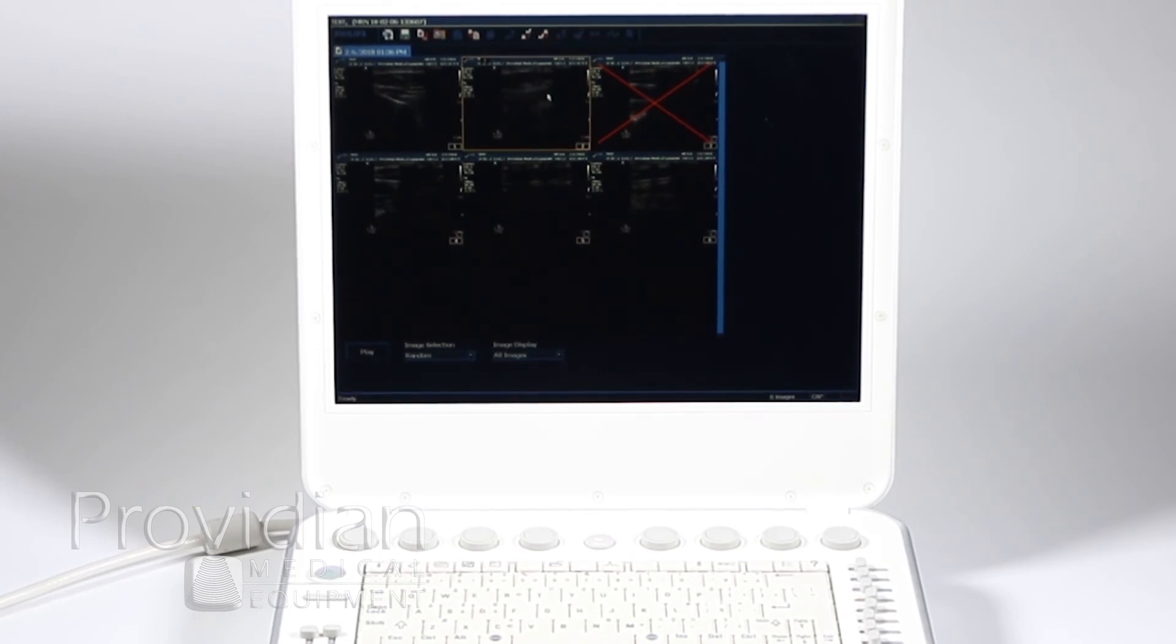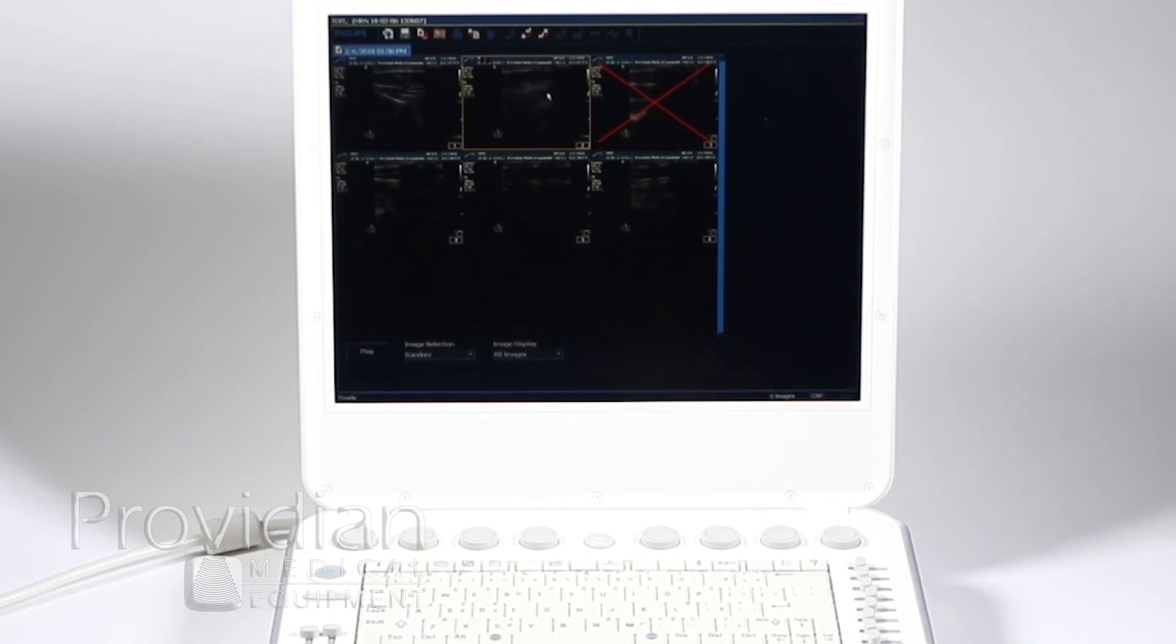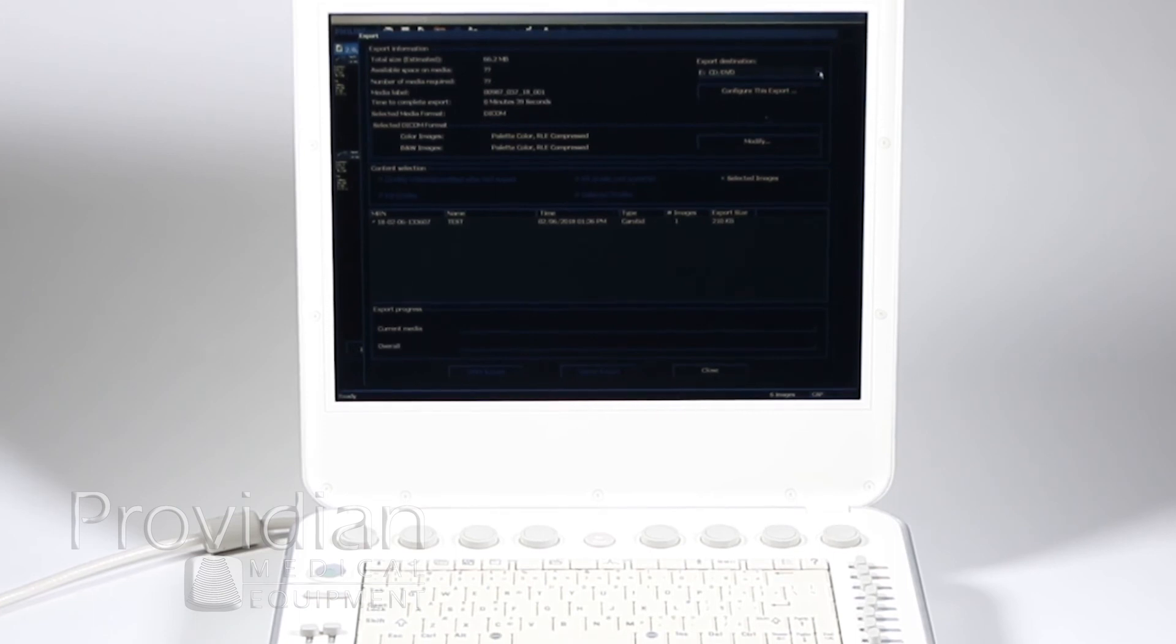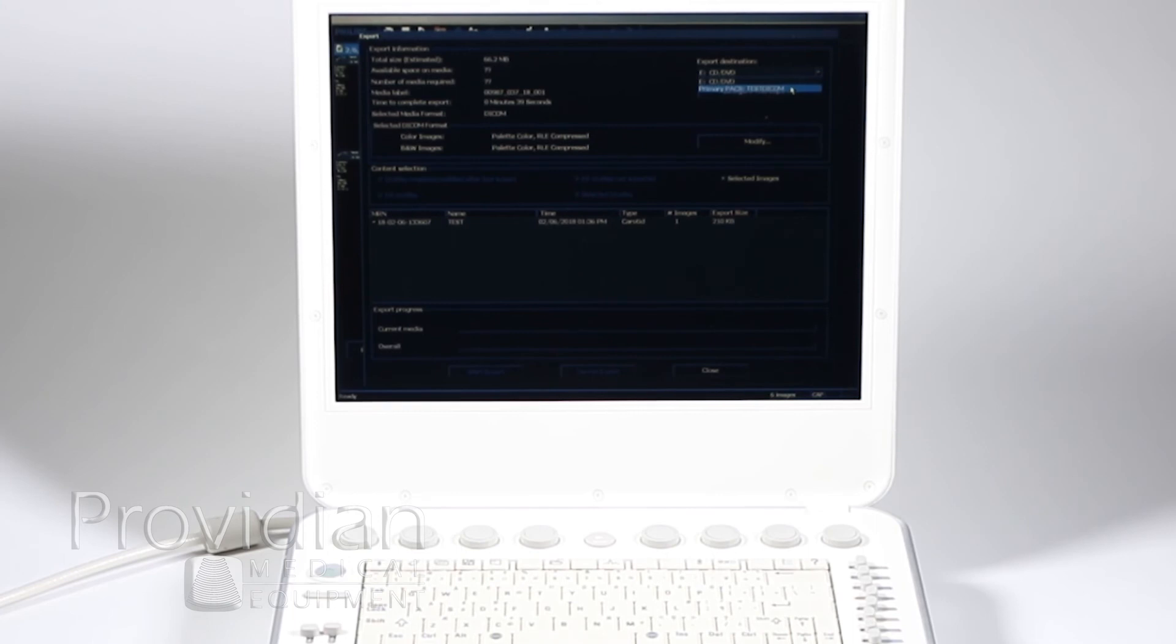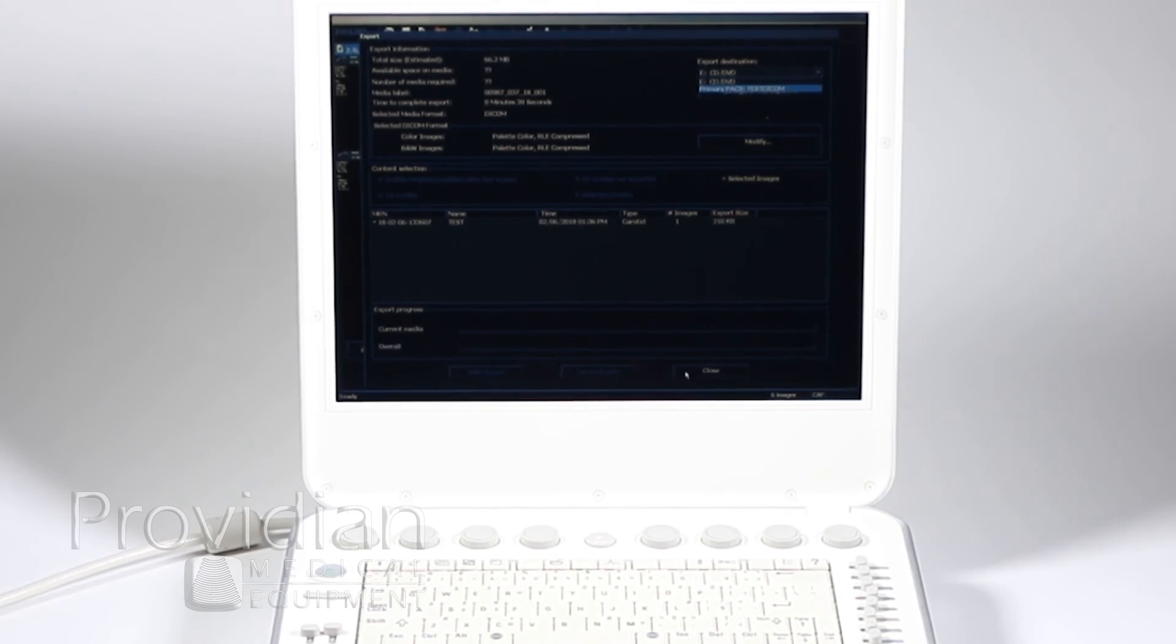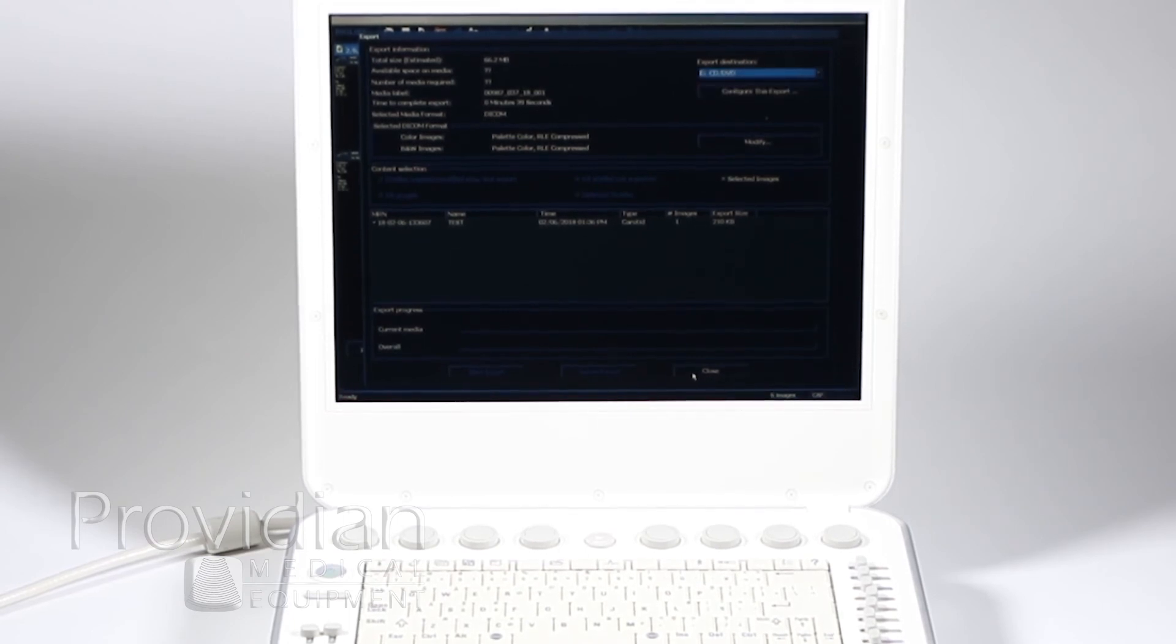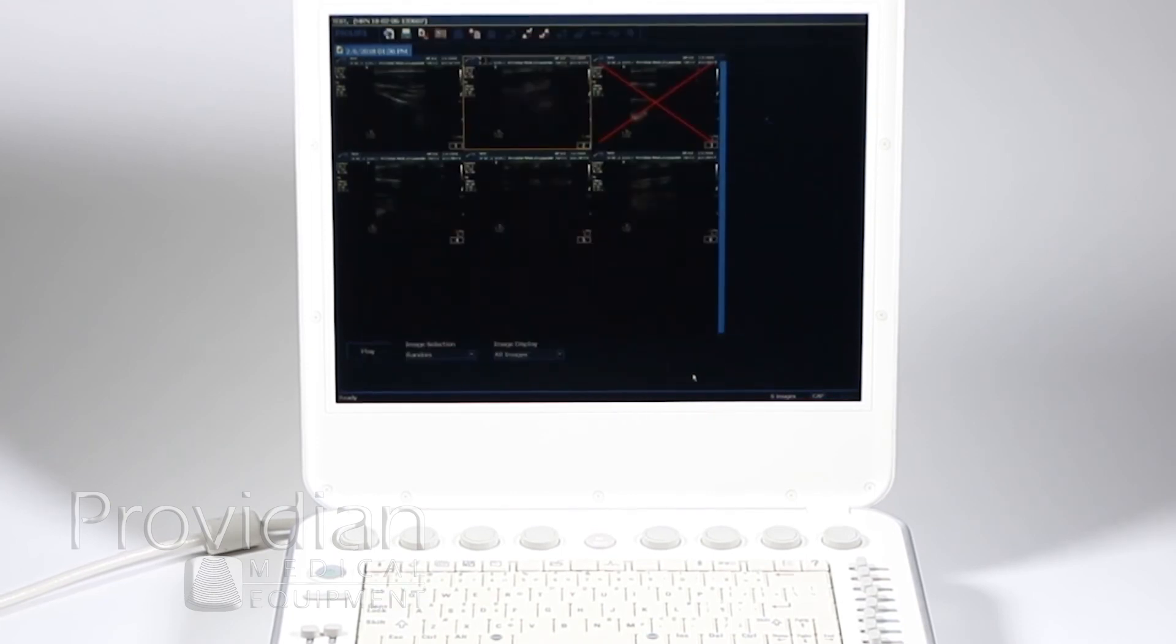And we'll get to image export later, but just real quick if you wanted to export it, you can click on that and you can choose—if there's a USB attached you could put it in there, or if you have a PAC system or DICOM set up, you can export to that as well. We'll get to that more later, but this is just another place where you can export that patient information.